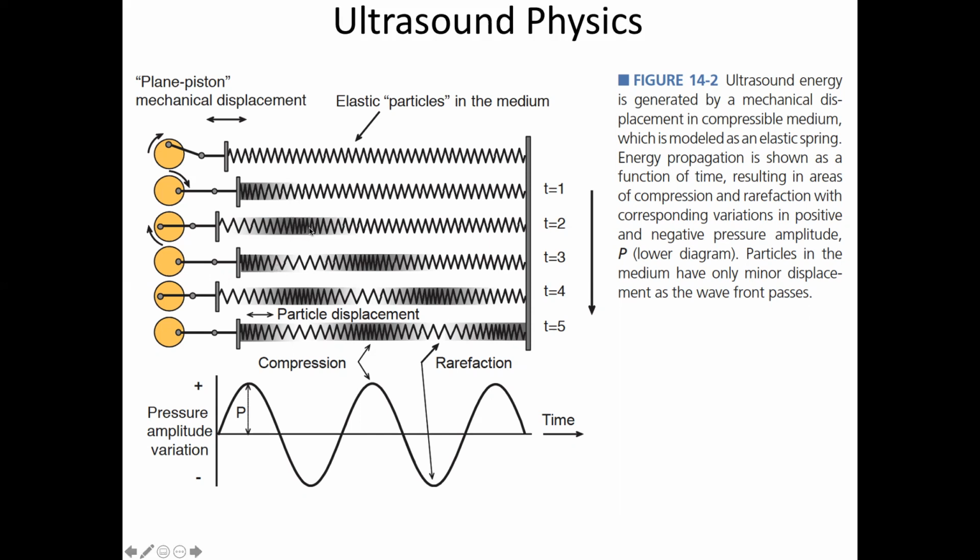And so it's this pressure or compression that is the thing that we're interested in. That's our signal, right? And what's going to happen is it will come down, and if there's something here, it will reflect off this surface and come back through the spring, right? Our spring in a human is the tissue itself, right? We're going to compress the tissue, and the simplest tissue is water, right? So we could do this in water. You could make a pressure wave go through water and come back up. You can do this in air, obviously, which is how we talk.